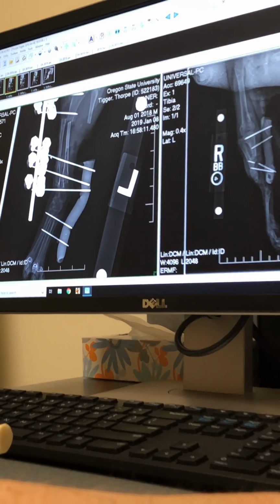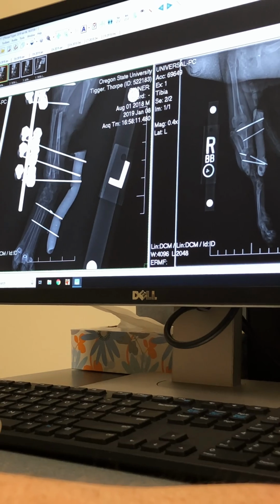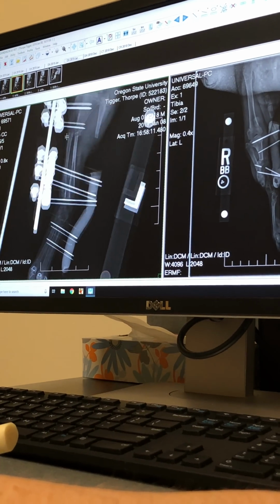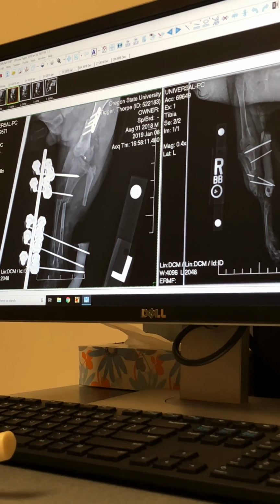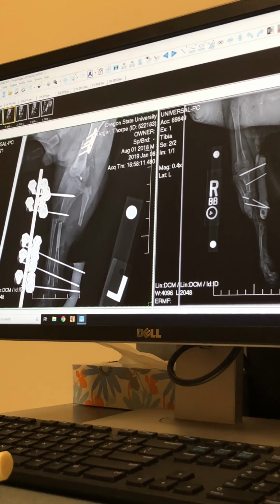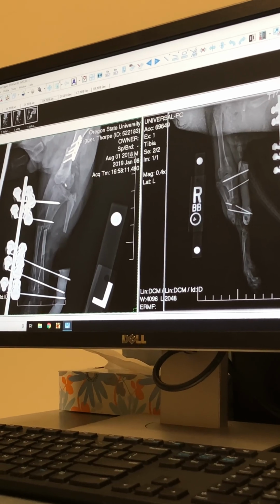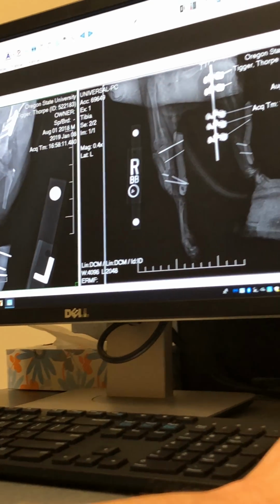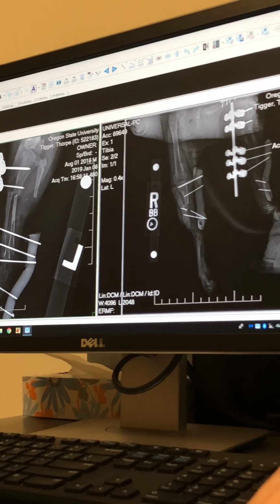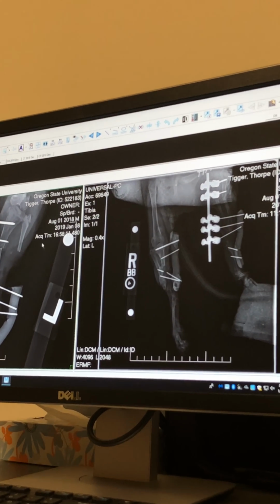And so we were able to put the pins going across all the way, which is really, really strong, and then into the foot here. So he will walk on this, and his knee joint is up here. So he'll bend the knee, and his ankle is fixed as if he has no joint there at all, which is better than collapsing. Does that make sense? Yeah. So it's essentially a peg leg from here down, there's no motion, but that's okay. He won't be a super great jumper, but he can at least walk around.